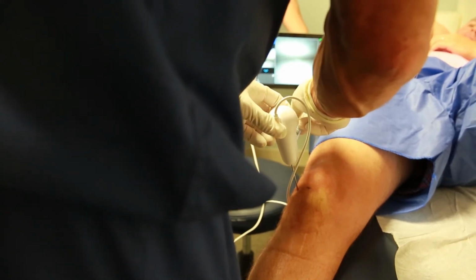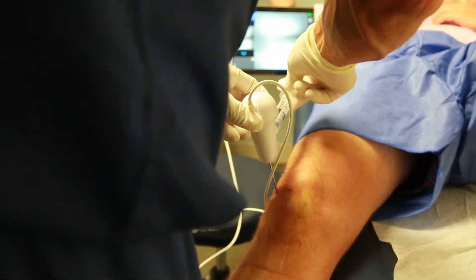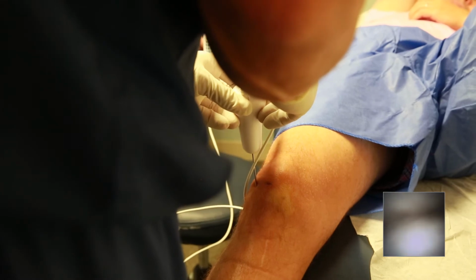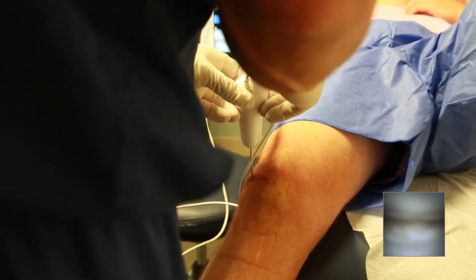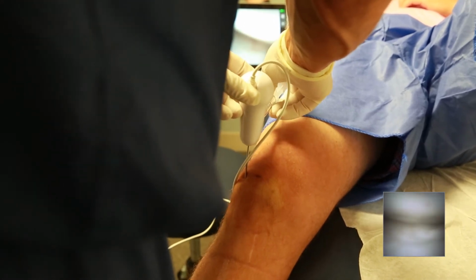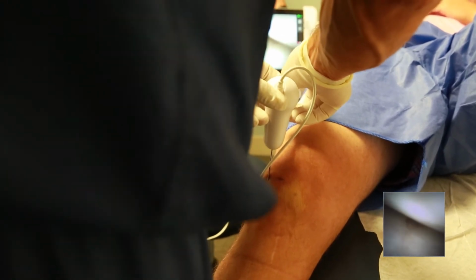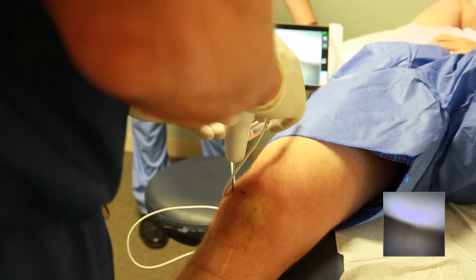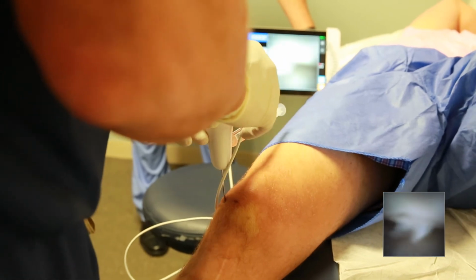You can see a little bit of arthritis right there. So we have some grade 2 to 3 changes on the outside of your knee, and that's more arthritic change, not overall. And then we'll see your meniscus right here. So there's your meniscus. You see a really good picture of your meniscus there. Now you see we're having a little trouble seeing this posterior horn right there. If I put a little bit of force on there, he's got that debris in there.